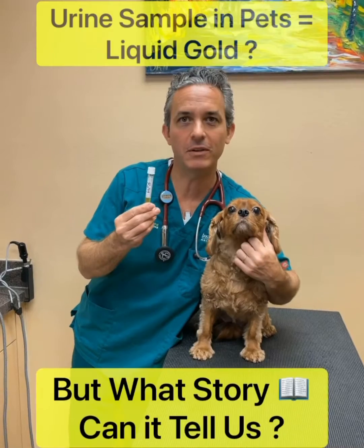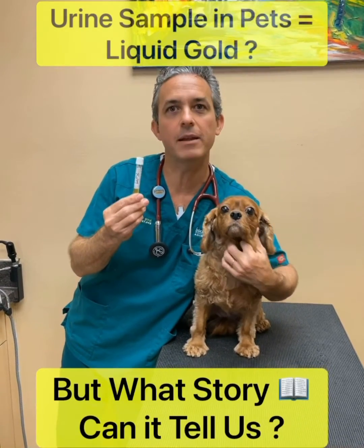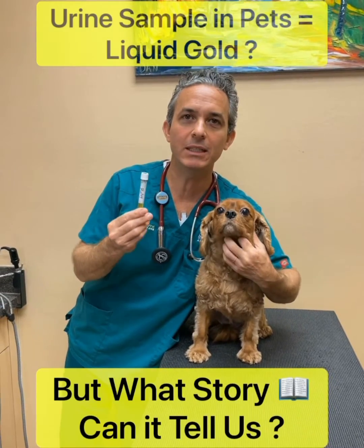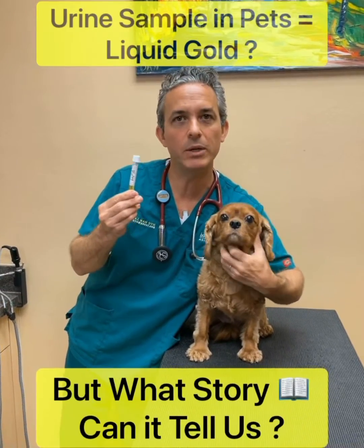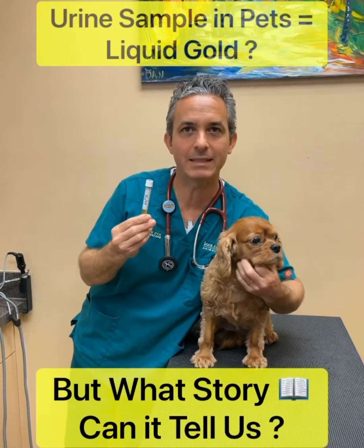This was a cystocentesis, which means we got the sample directly from her bladder with an ultrasound-guided fine needle aspirate. That's important because if we see any bacteria in the urine, we know it's real — we got it directly from the bladder. It's not contamination, and that is a sign of infection.